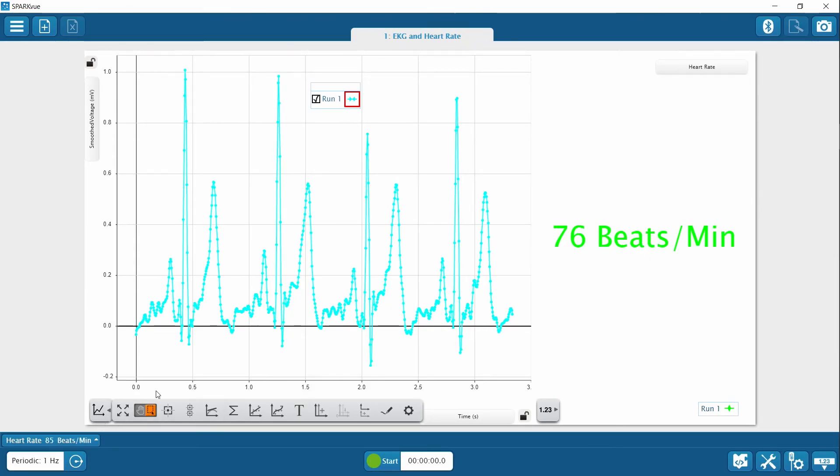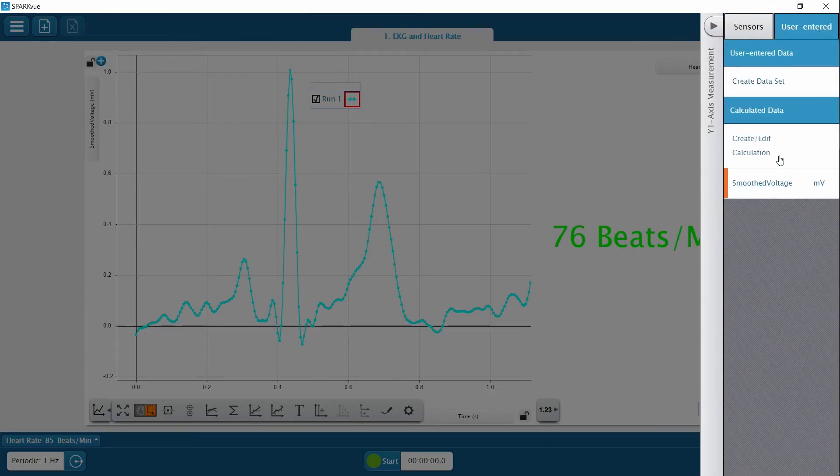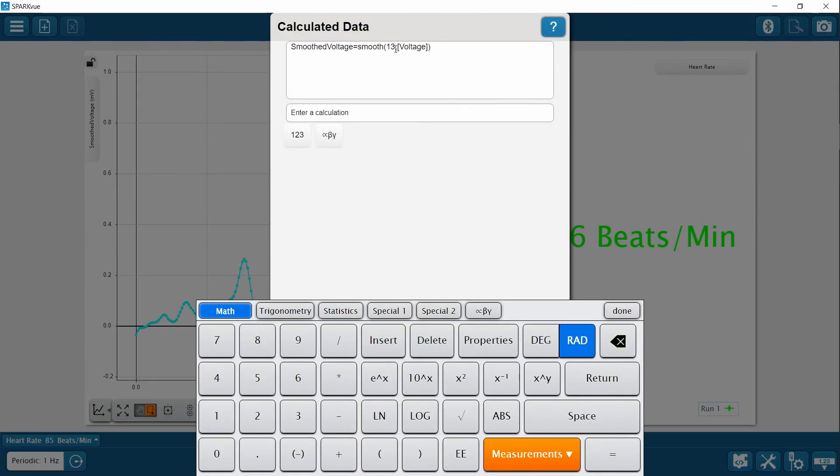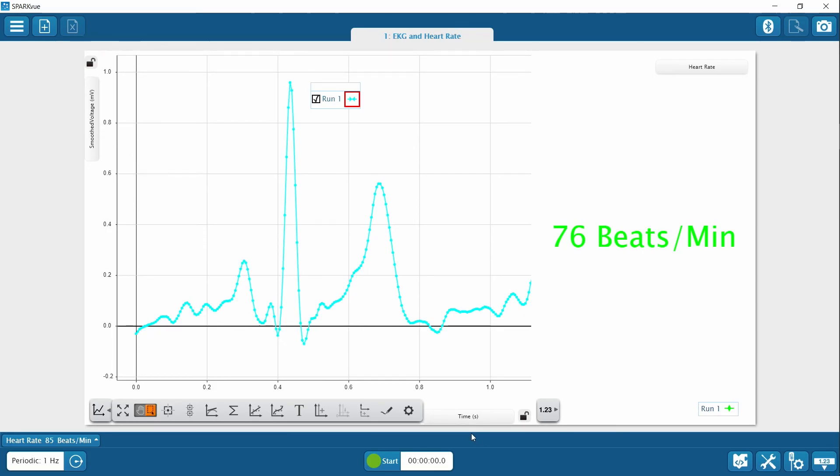Let's see how the data looks now. Make sure to scale the data. You can customize the amount of smoothing — just go back to the user entered menu and choose create/edit calculation. Adjust the number in the equation to an odd number, 5 or higher. We see the waveform is smoother, but you may notice the amplitude of each wave is smaller. So it's up to you to decide whether to change the smoothing or use the default setting.